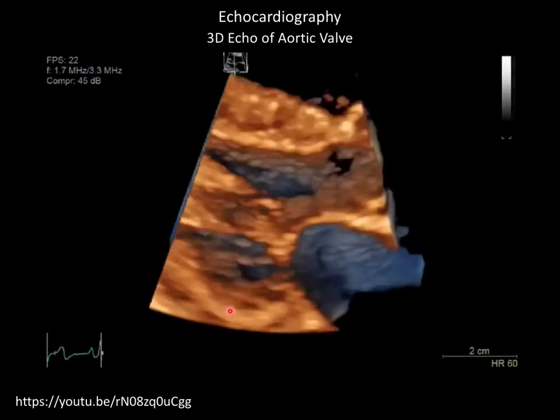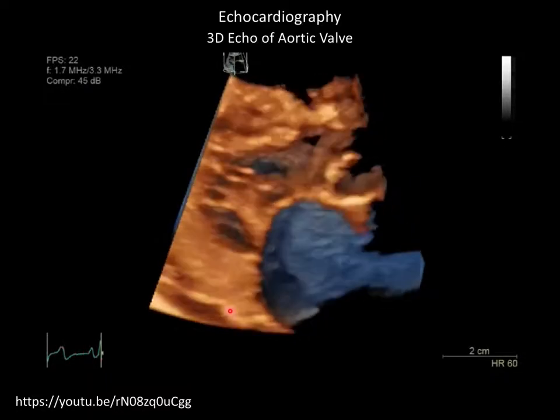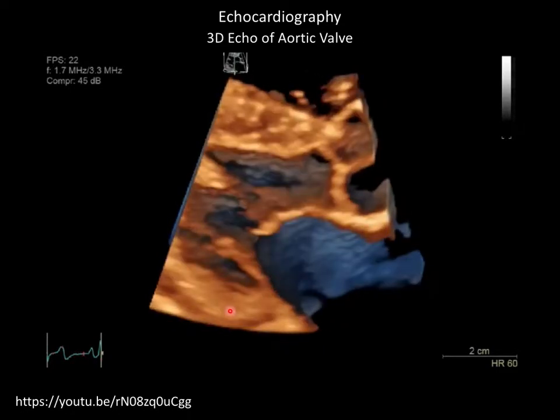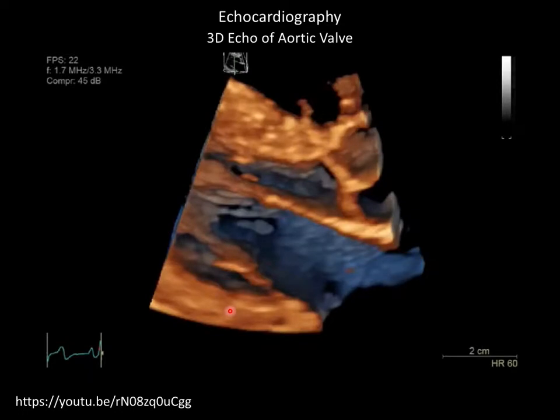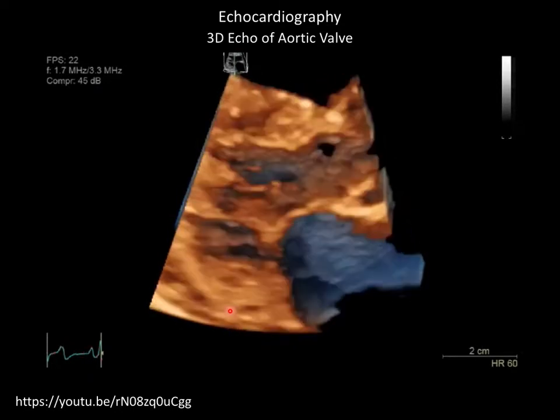This is not something that's unique to echocardiography, this assumption that each heartbeat is the same and that we're going to use multiple heartbeats. This is also used in magnetic resonance imaging. And most of the time, to get a really nice high-resolution magnetic resonance image, you need at least 8 heartbeats, something like that.